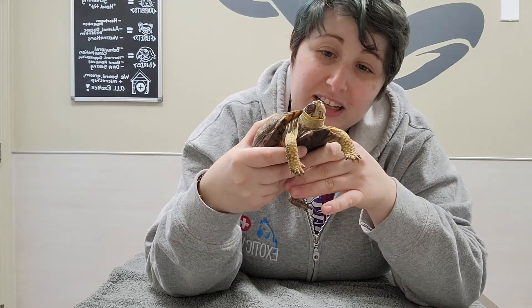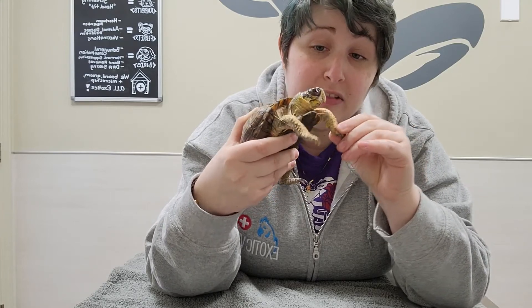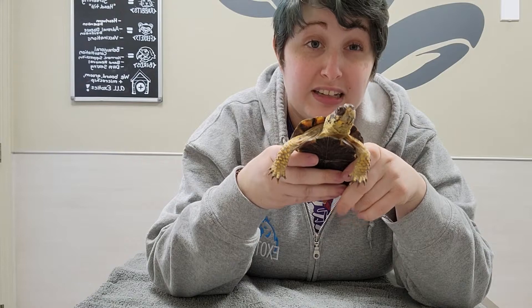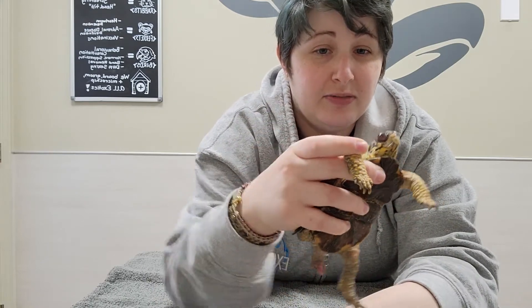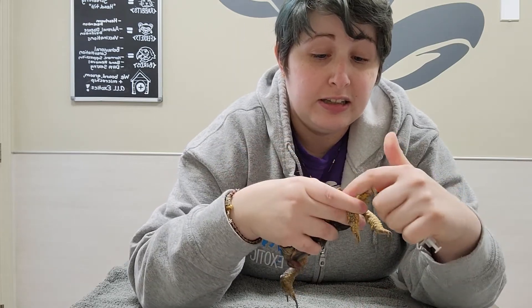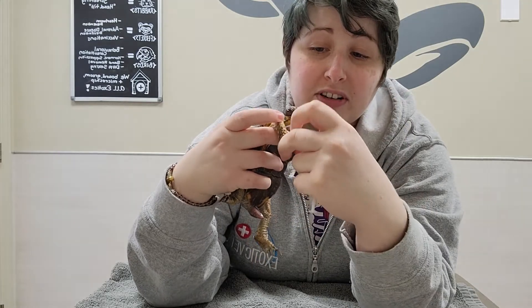We always give injections in the front half of the body — we usually go between the two front legs here. With a smaller turtle or tortoise, I'll kind of trap the leg with one finger like that, and then take our syringe and find a nice meaty spot on them.